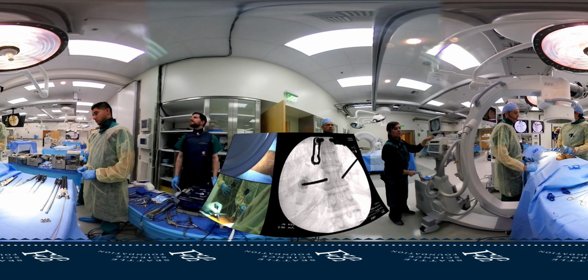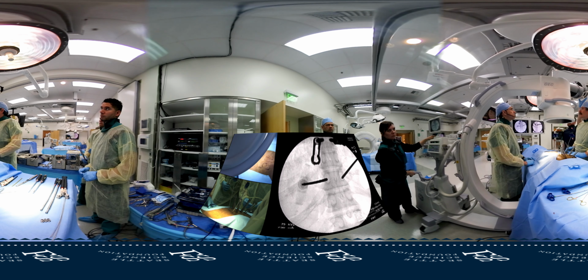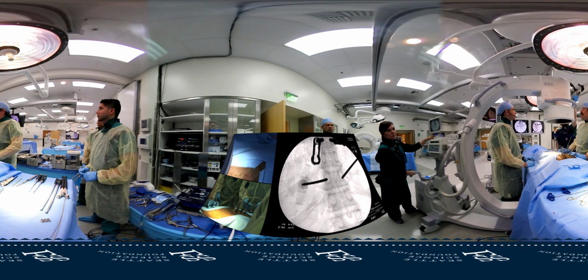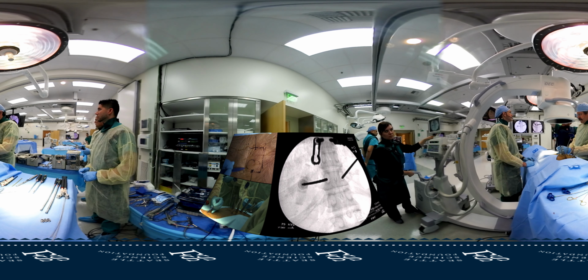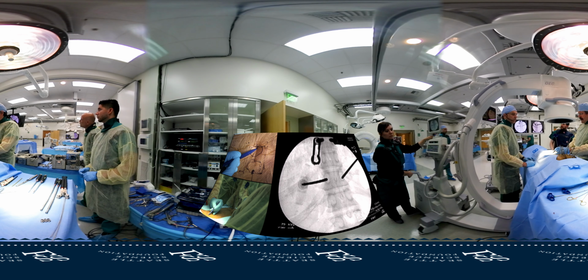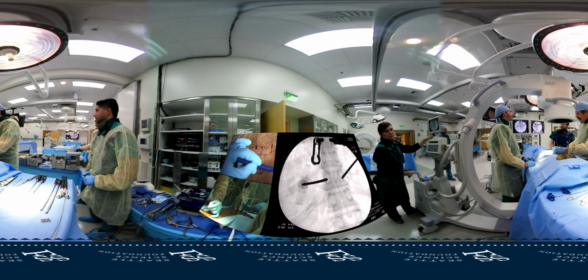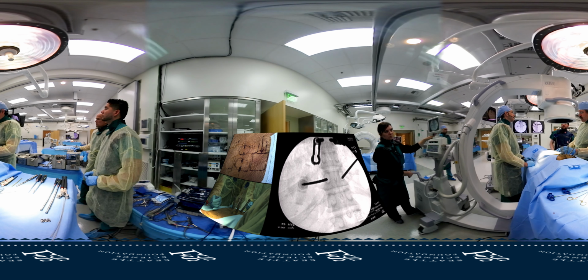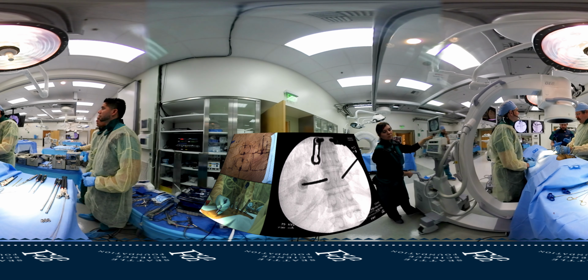So right now what I've got, if we can focus on the lumbar spine here, put one right there. Can you see that? So as I'm working my cannulas into the bone, I'm going to see the tip of this move lateral to medial because I'm converging as I go into the vertebral body. And so I don't want to see that tip cross this medial border until on the lateral I've reached the back of the body. So if I'm coming in this way, once I hit the back of the body, if I've not crossed the medial border, I know I'm safe within the angle of the pedicle. I know I'm safe in here.